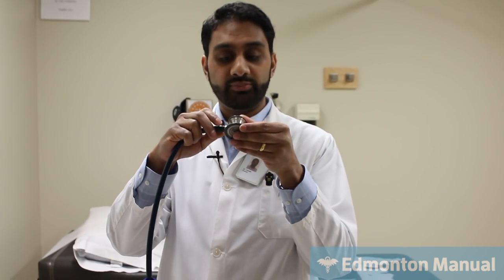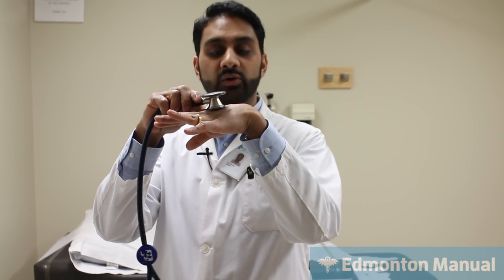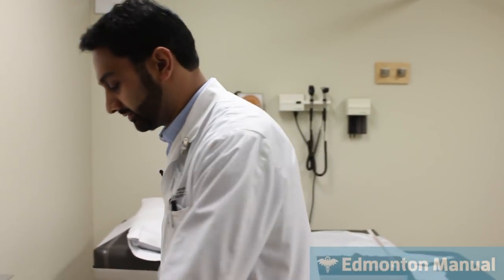You can do that on both sides of the stethoscope, pushing down hard for diaphragm or just barely making a seal to act like a bell. This is very convenient as a medical student as you're rotating between both adult and pediatric settings. Family medicine is an excellent example where patient one can be an adult, patient two can be a child, and so it works very well in that way. However, there is the option to convert it to a more traditional bell, and I'll show you that now.